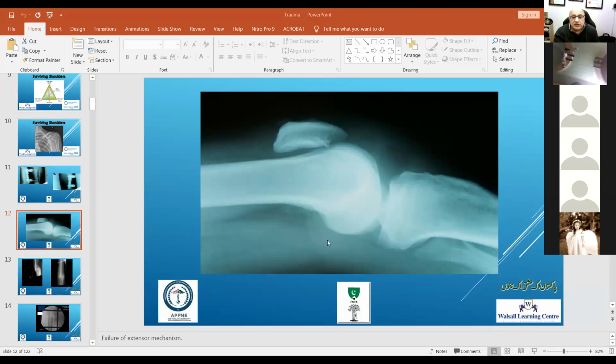So you can see a picture of a knee with a patella. Okay, so can somebody describe what this is then? What are you seeing? I don't have a second view of it, but what do you see on this picture? Sir, this is a lateral view of a skeletally mature knee, showing the distal femur, tibia, and fibula. But instead of saying that, it's showing the knee joint.